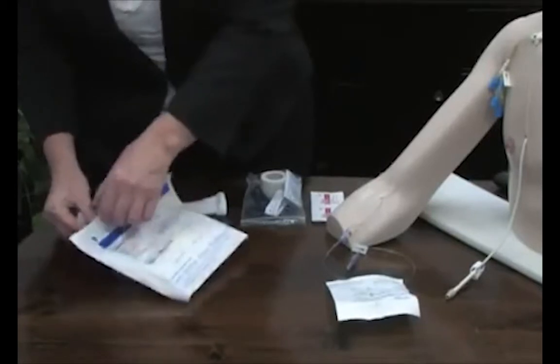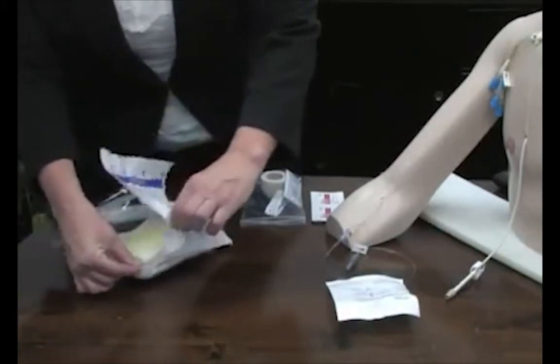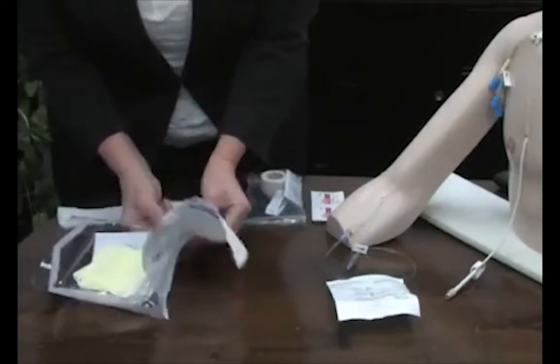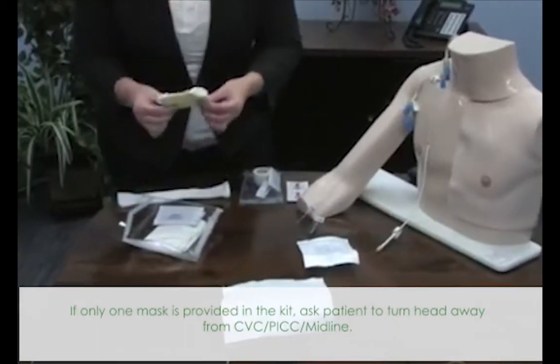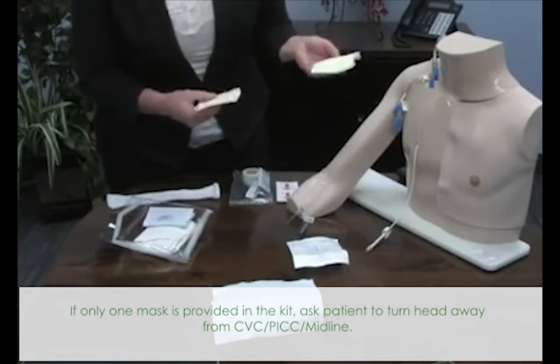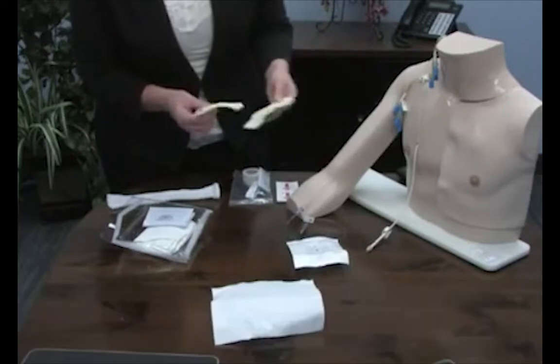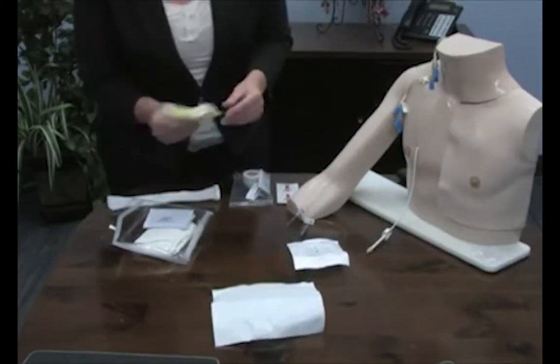When I open up a package, I do the whole thing. Some people just open it up enough to let the flap open up. I take the whole thing off. Just one of those little preferences. I would put on a mask and have my patient put on a mask, explaining to them why, to prevent any kind of breathing on the site. I'm not going to wear the mask for the purpose of the video so that you can hear me clearly.